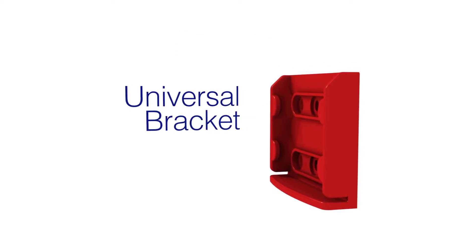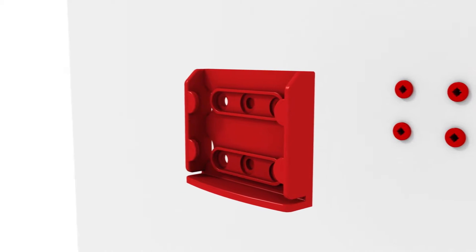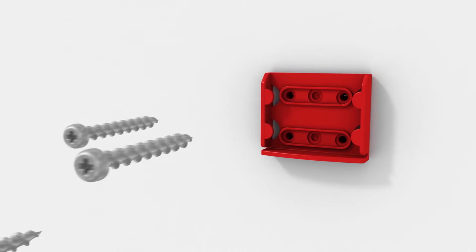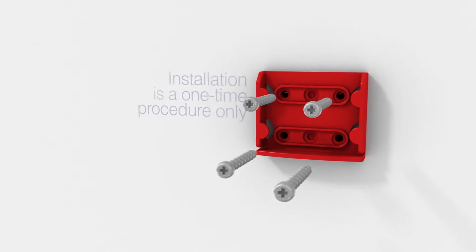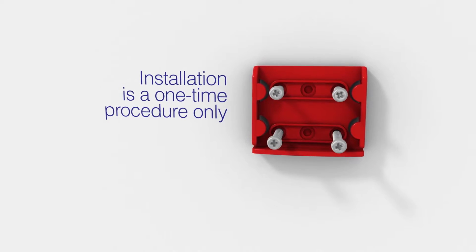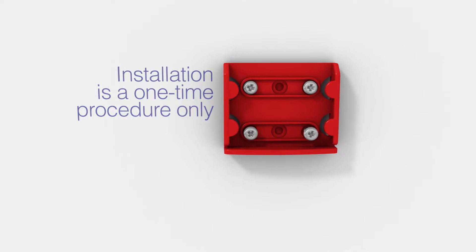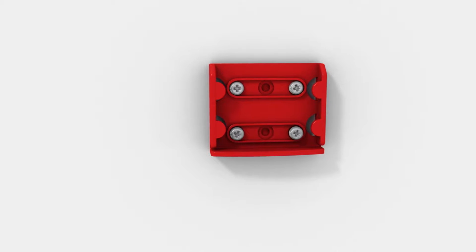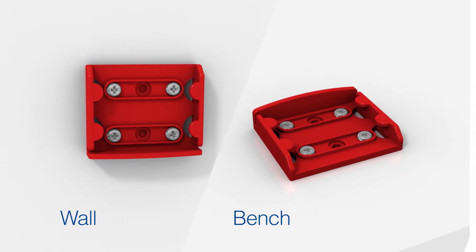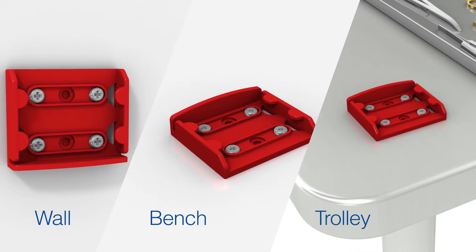In order to use Blade Flask single-handedly, the universal bracket for mounting the blade flask must first be installed. The step-by-step instruction page on how to do this is included within each bracket box. Installing the bracket is a one-time procedure only. The bracket can either be positioned on the wall, on a bench, or on a trolley. Always refer to the template supplied while positioning and fitting the bracket.